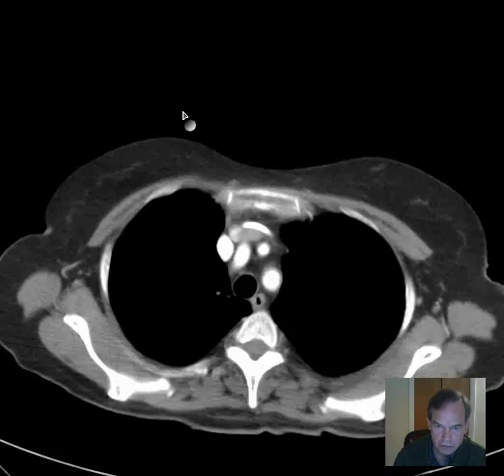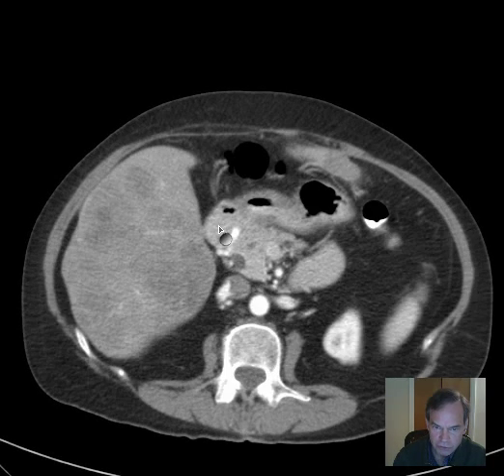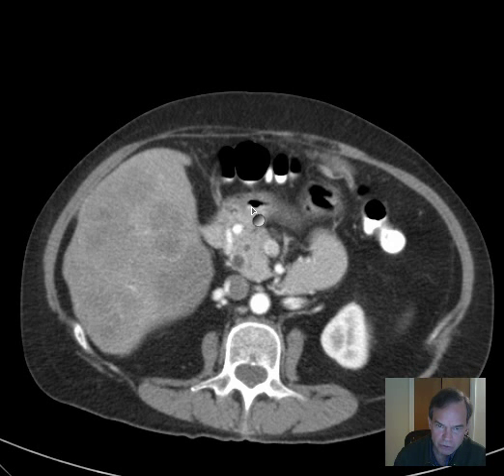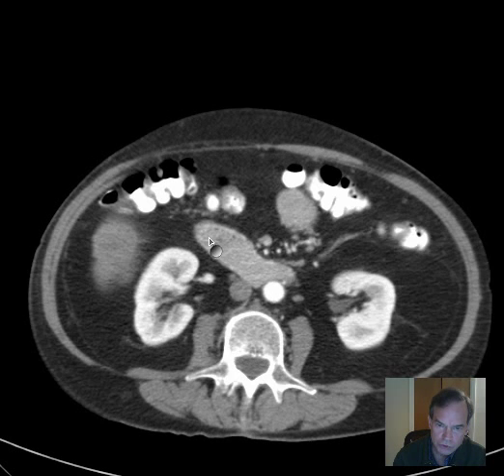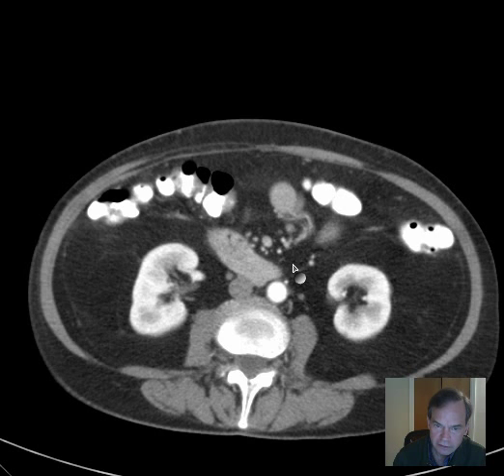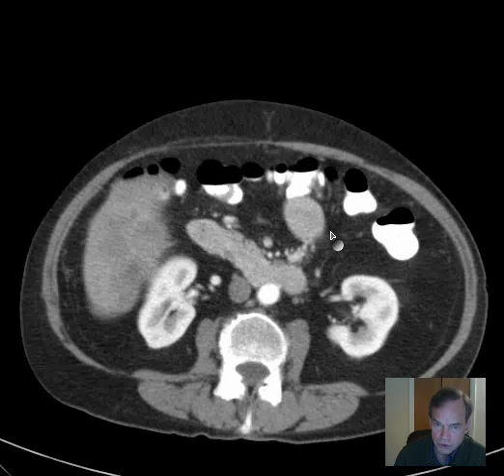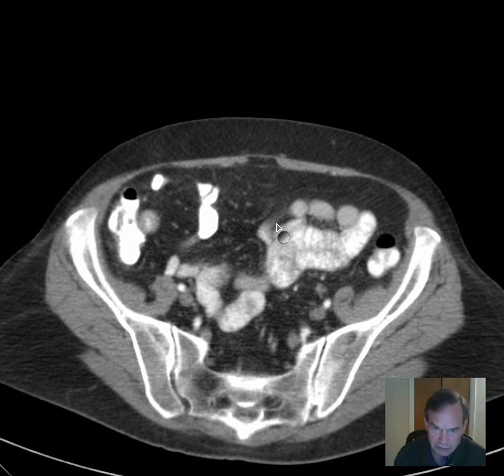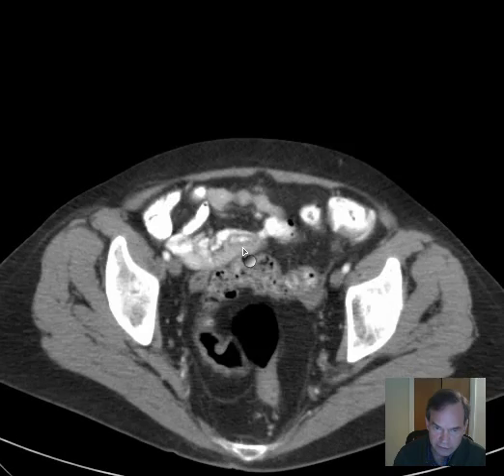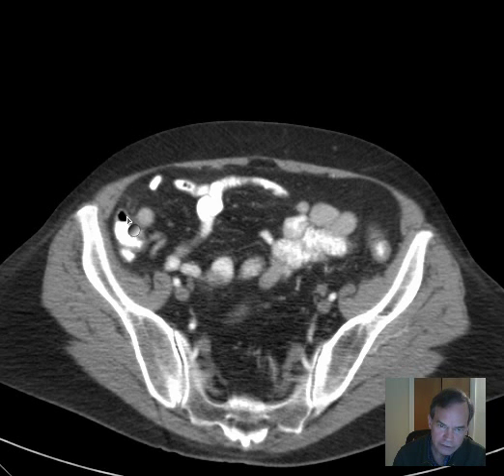Back to the axial images. No retroperitoneal masses. Here we have the duodenum. The stomach crosses over the midline; the duodenal bulb is in the first portion of the duodenum. Then the second portion of the duodenum courses inferiorly from there. The third portion crosses the midline. Then you have this ascending obliquely-oriented segment — the fourth portion of the duodenum — immediately proximal to the jejunum. The jejunum courses throughout the mesentery, transitioning to the ileum more distally. And once again we can see the terminal ileum coming into the right colon at the ileocecal valve.